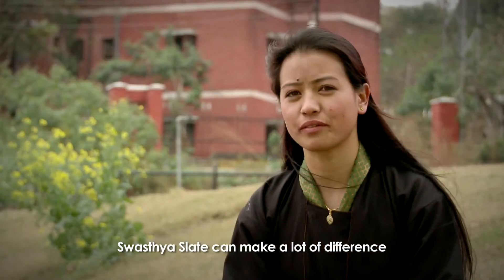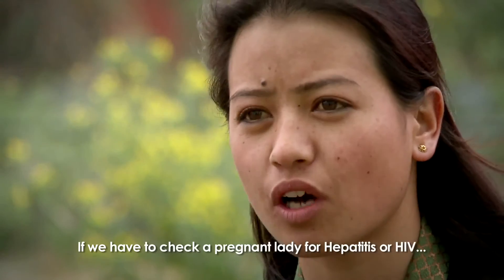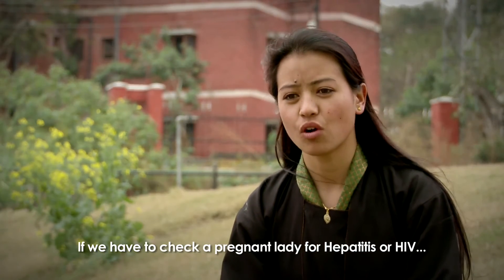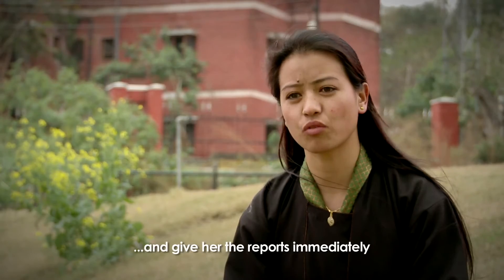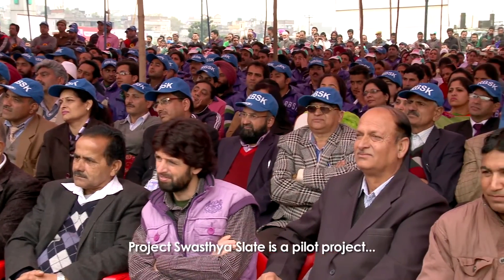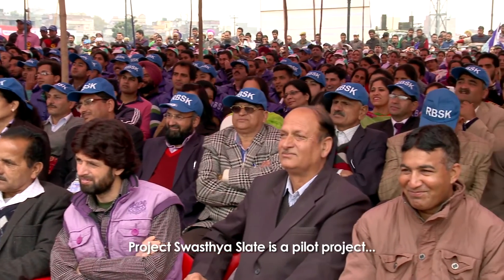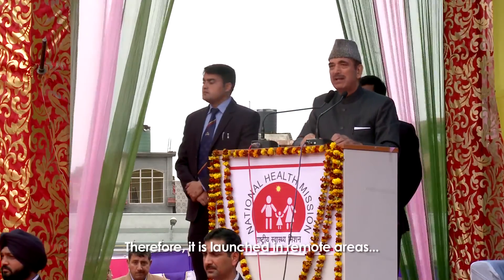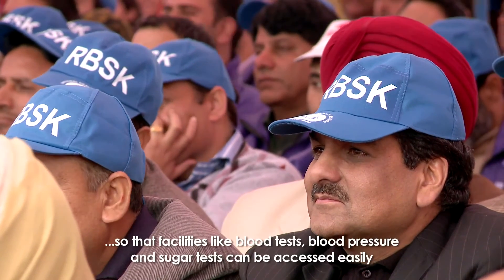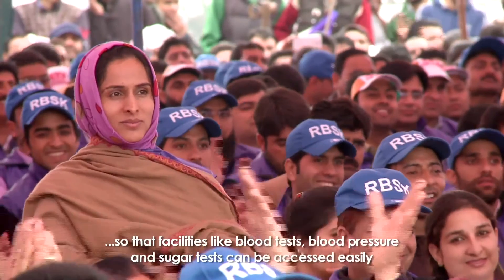With the Swasthya Slate, we can detect HIV positive or hepatitis. We can see it easily and we can see it as a report. This pilot project is for all the areas where there is no laboratory — it can be given in those areas. It can be used at a distance. The blood test, blood pressure, sugar test — all of these are available.